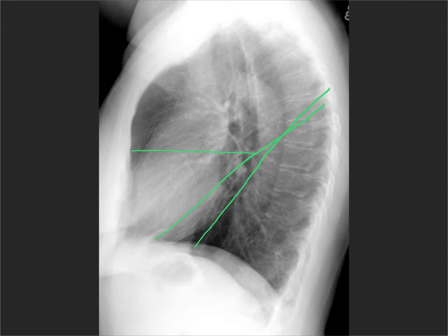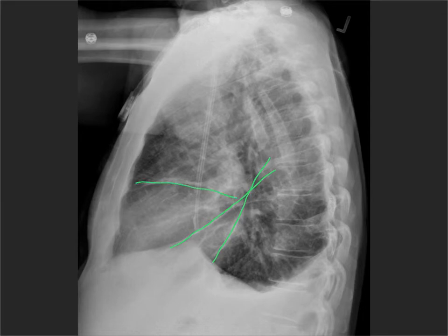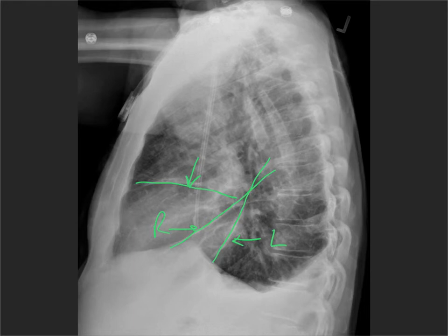Here's an example where you can see these a bit better. This patient is in pulmonary edema and has been kind enough to show us at least some of their major fissures bilaterally, as well as their minor fissure. This one is going to be the left one, this one will be the right one, and this is the horizontal or the minor fissure.